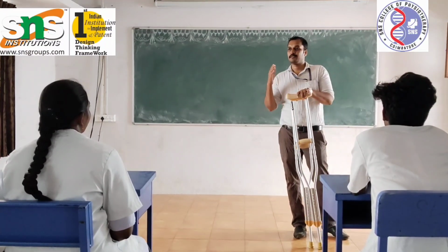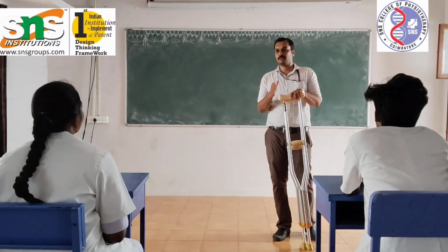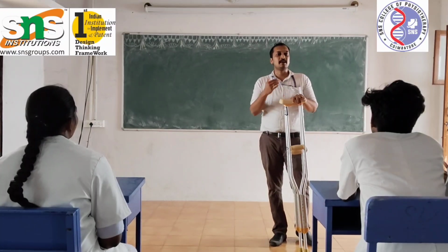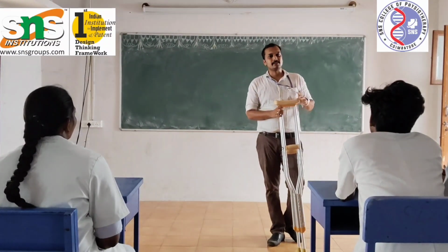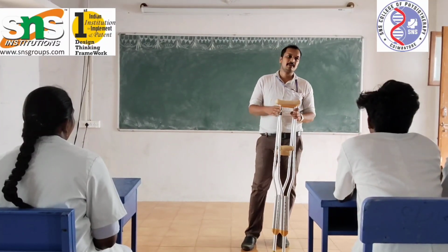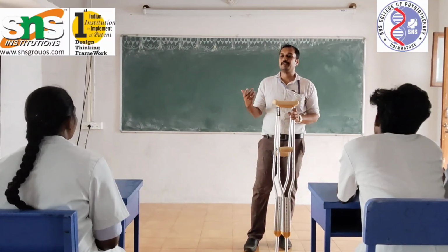Walking aids are aids that assist in walking. So it's called walking aids. They are supportive or assistive devices which assist in walking. Okay, so what comes under walking aids? Crutches, cane, then walker. So in English there are various types.